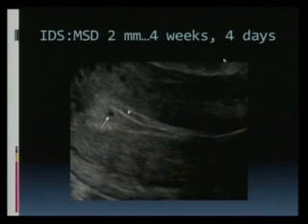We have, right? So the first thing that I look at this and say, this is probably a true gestational sac because it does not occur within the endometrial cavity. It occurs eccentrically within the endometrial echo, right? Because it is not a content of the endometrial canal. It is something that, where the sperm and the ovum met in the endometrial canal, but the embryo implanted itself or buried into the endometrium to house there. Do you understand that?